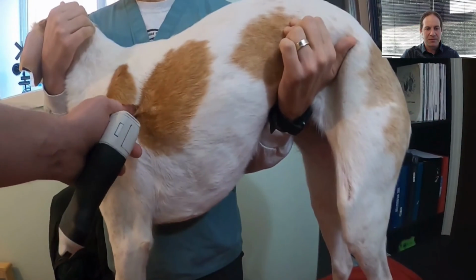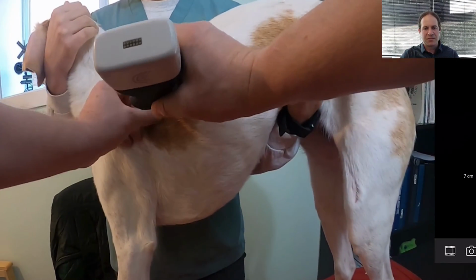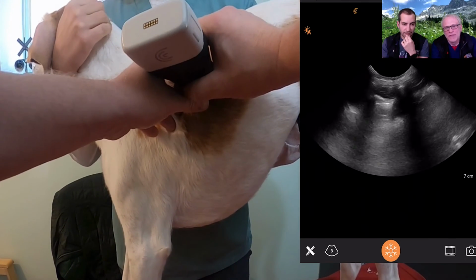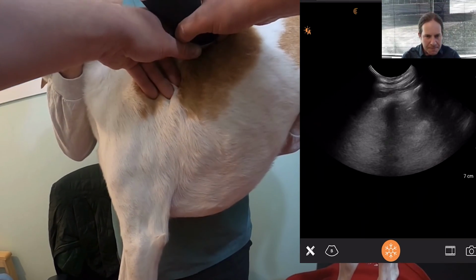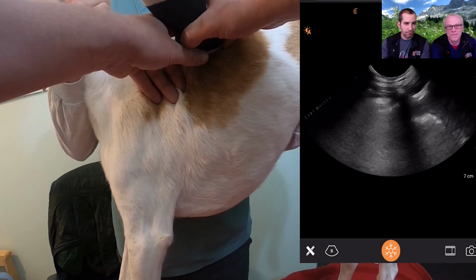Pop the probe on with a marker towards the head. Separate the fur. And we're just basically going to go straight back until we find that curtain sign. You see, I'm moving with my left hand the skin and the site of contact after I've parted the pleural line and that back. And I can just move and compare the whole thorax, just looking to see that curtain sign again and that pleural line, and we assess the sites of contact there for the glide sign.